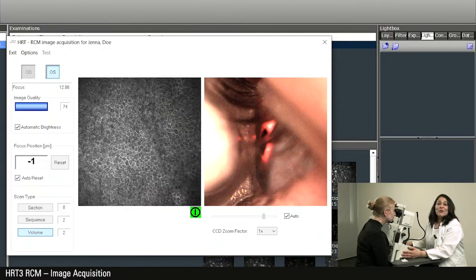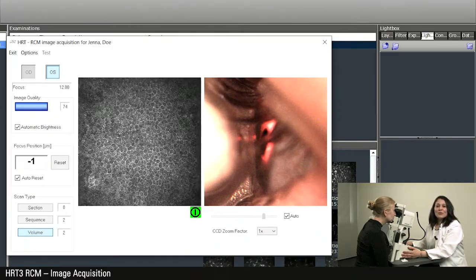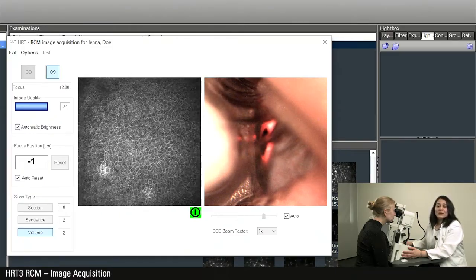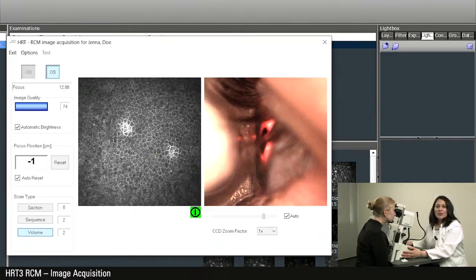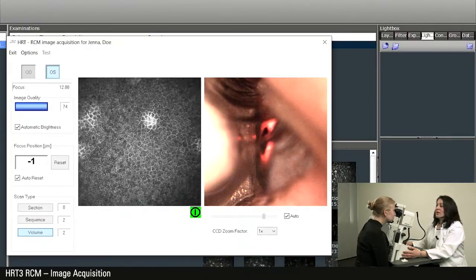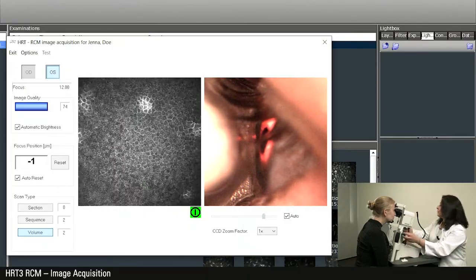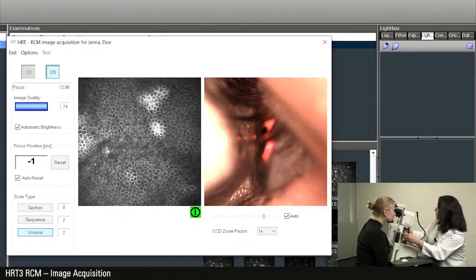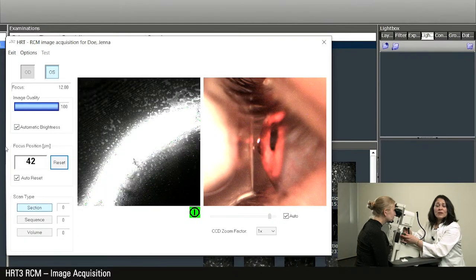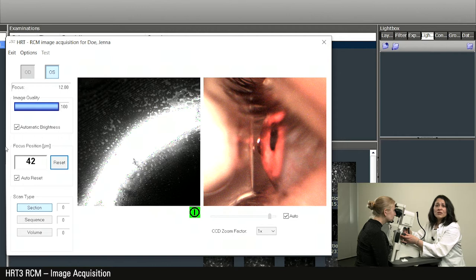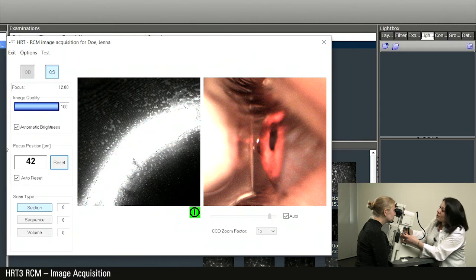In the following illustration, I would like to show you tips for capturing good images. Always check the contact from the tomo cap to the eye during the examination. If there is no contact between the tomo cap and the eye, you will not be able to see any live images of the corneal layers. In this case, move the camera slightly forward again until sufficient contact has been established.